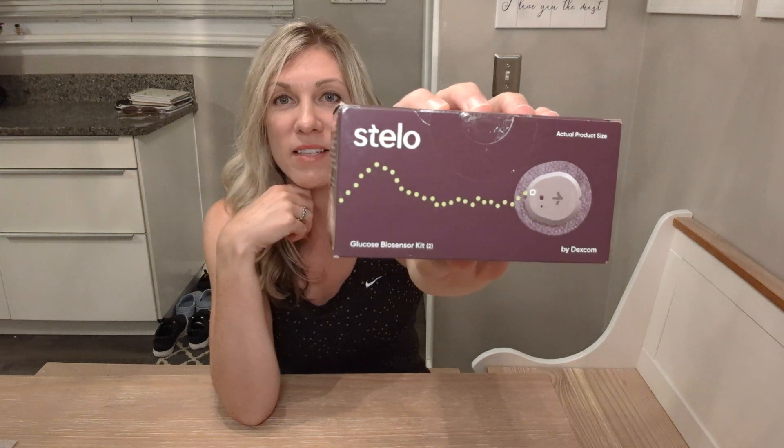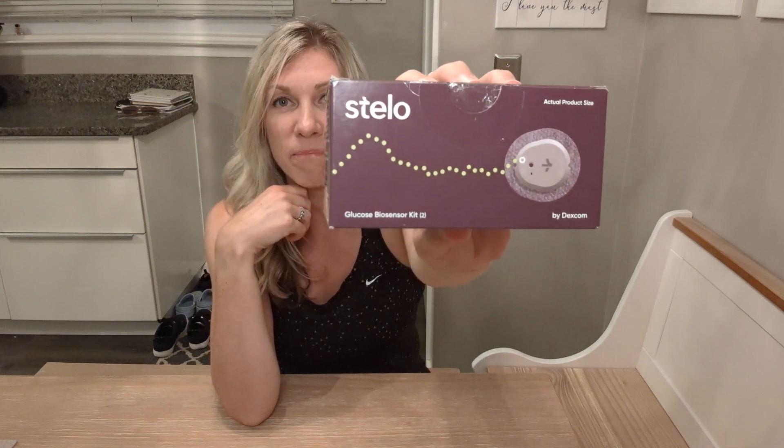Hey everyone, I am doing my very first unboxing video and it couldn't be on a cooler product — a CGM, or continuous glucose monitor. This happens to be the Stelo by Dexcom. I ordered this and it was delivered within less than 24 hours. I don't know if I was just lucky, but that was pretty cool.